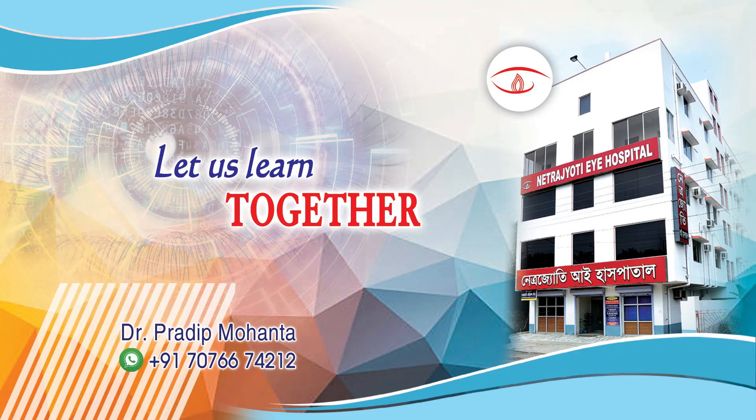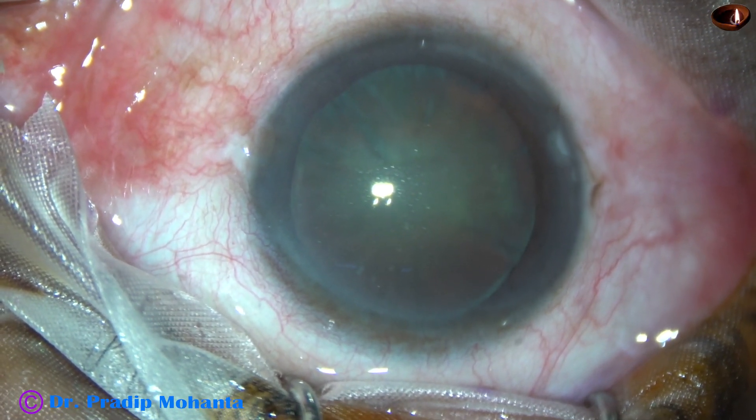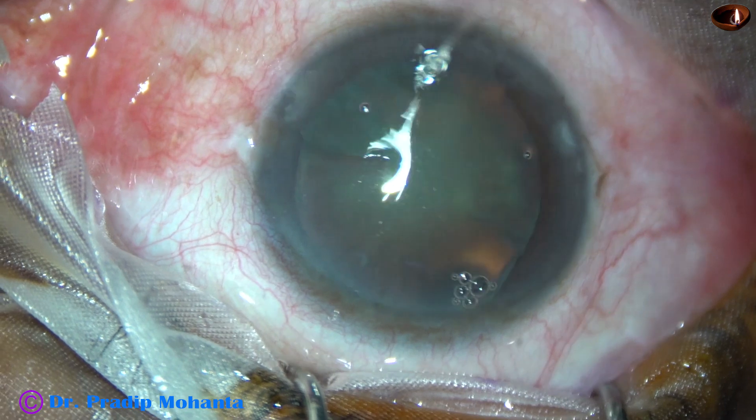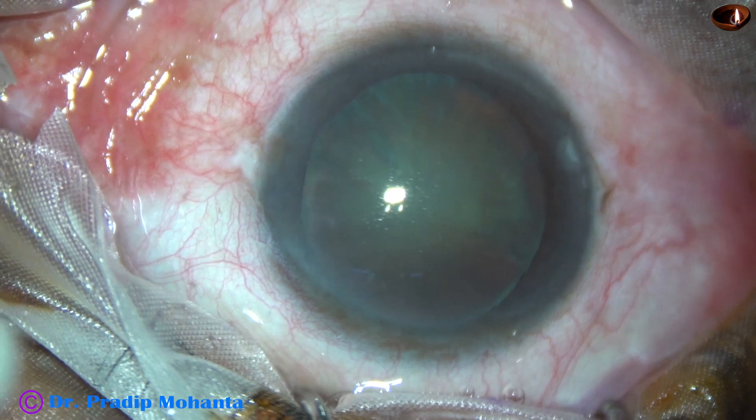Friends, welcome to my workplace at Ranak Heart, West Bengal, India. In this video, we are going to see the divide and conquer technique of phacoemulsification. Let us observe the surgery.